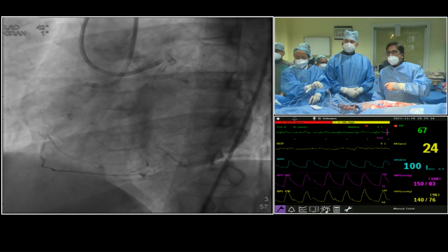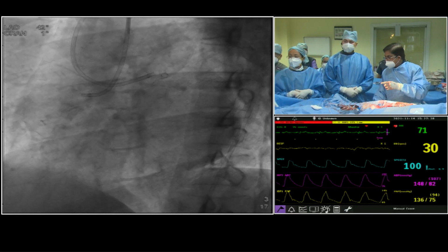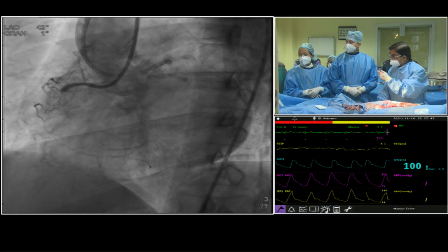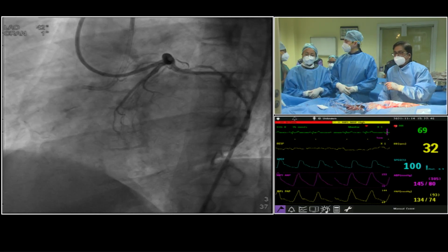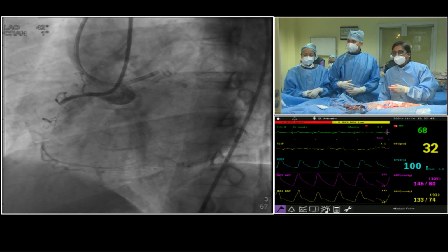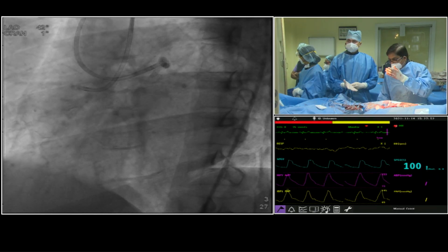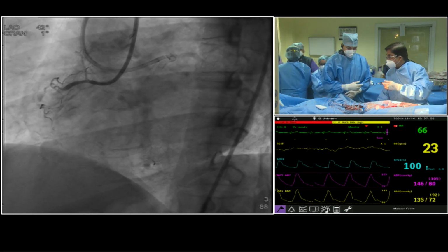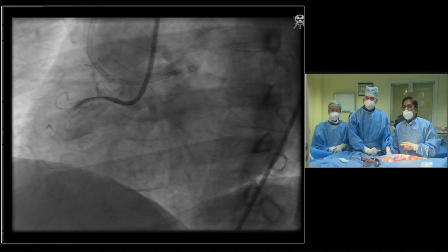The favorable factors there. You see, this was actually patent. Can you show that previous angio, the RCA injection before? If they can show it, then only you will understand that, because I have seen that. Now, can I see the RCA injection, please? Can you inject for me? Yes, RCA. Inject, please.